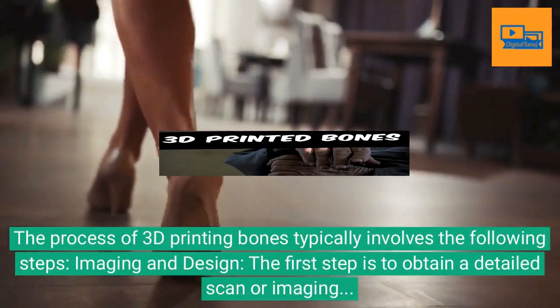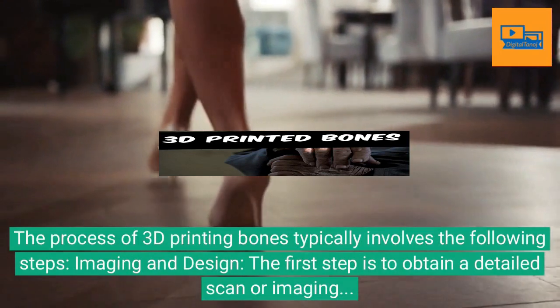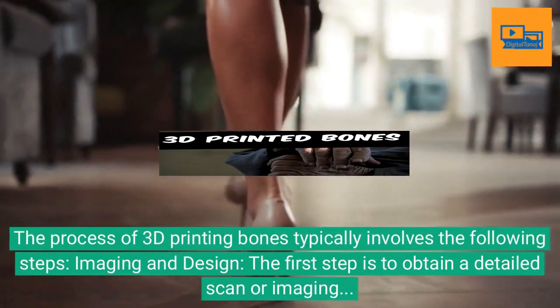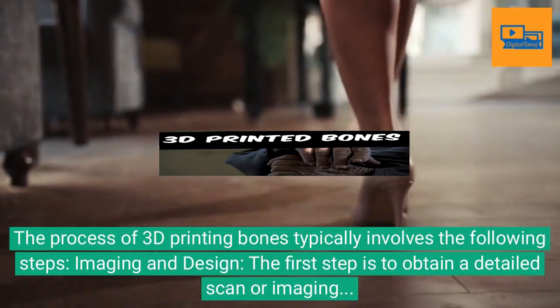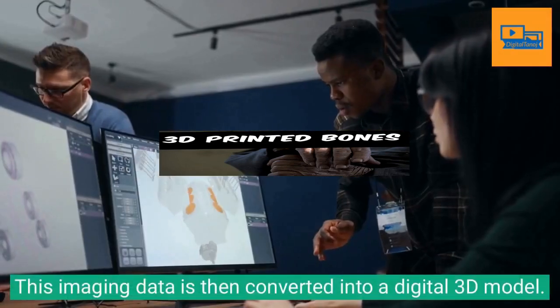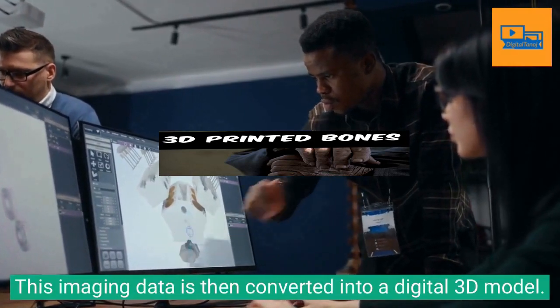The process of 3D printing bones typically involves the following steps: imaging and design. The first step is to obtain a detailed scan or imaging of the patient's bone structure using techniques such as computed tomography, CT, or magnetic resonance imaging, MRI. This imaging data is then converted into a digital 3D model.